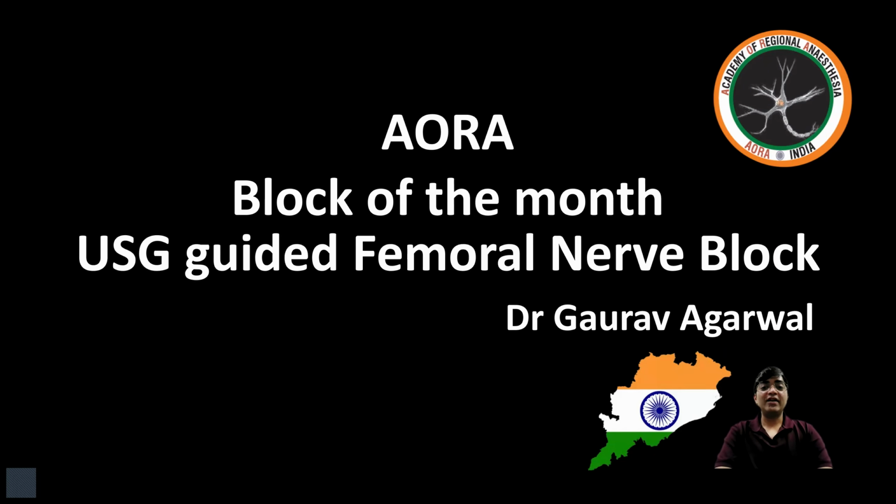Hello, I bring you the block of the month for AORA, and my block is USG Guided Femoral Nerve Block.